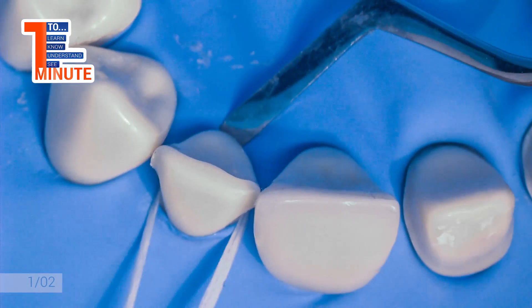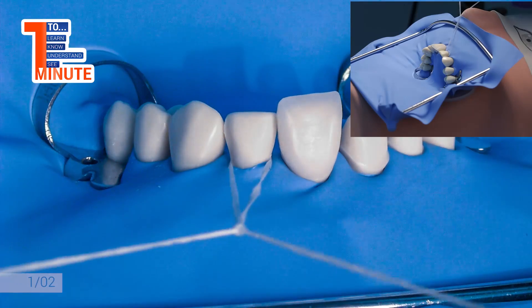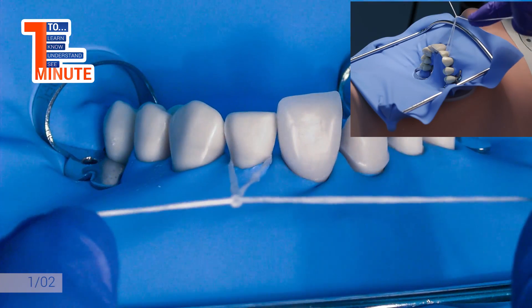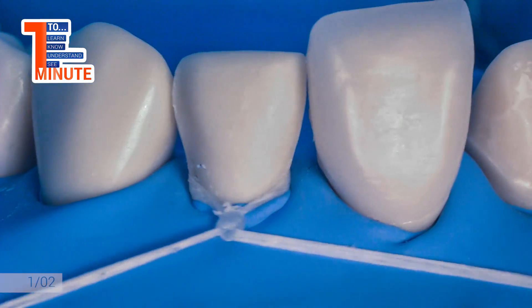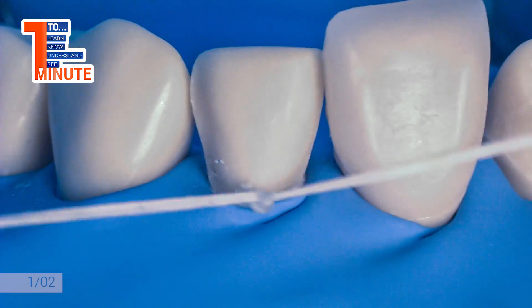A single floss loop is placed around the tooth. The assistant is securing it from the lingual side by spatula, as apically as possible. At the same time, the dentist is tightening the knot labially, moving it to the most cervical part.